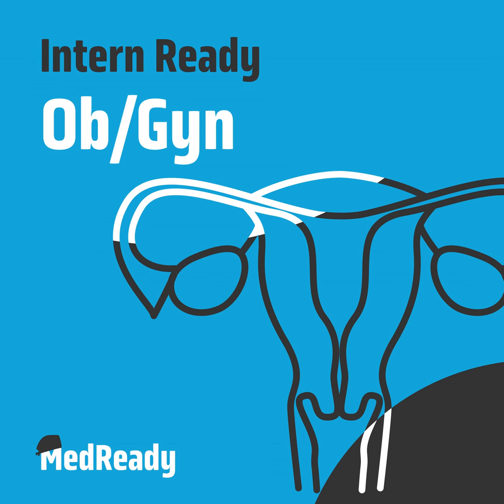Previously, there was historical use of carbon dioxide, but it's not been used as much because it can increase shoulder tip pain and the risk of gas embolism. Now, most commonly, like Lucy said, we use isotonic solutions. Normal saline is the most commonly used. It's really the preferred distension media. The advantage of this is that it is isotonic, so it has the same osmolality and sodium concentration as blood.